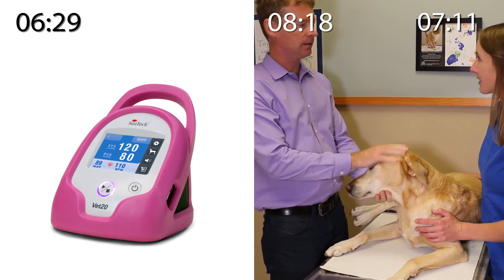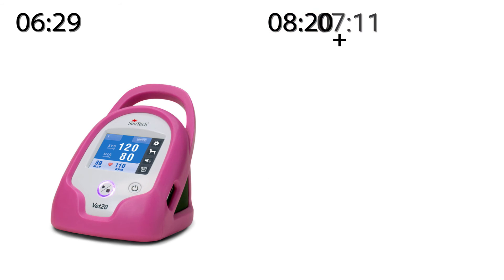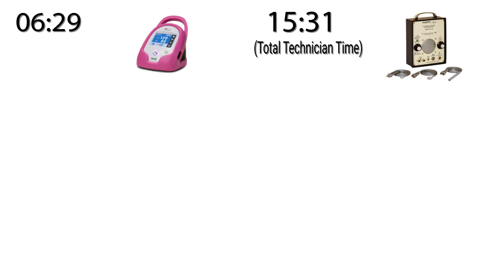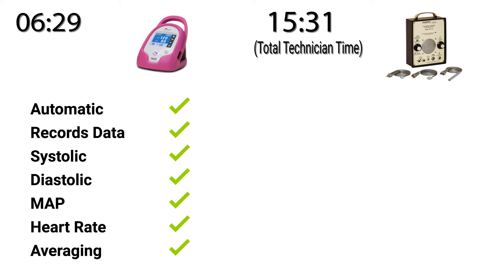Tucker did great! What a good boy! This has been a demonstration of two very different methods for measuring blood pressure. On one side, we saw the SunTech VET20 oscillometric blood pressure device, which automatically inflated and deflated the cuff and recorded the blood pressure values. The VET20 gave the technician a value for systolic, diastolic, and mean arterial pressure in addition to heart rate. Finally, the technician was able to easily average the measurements using the built-in selectable averaging feature.